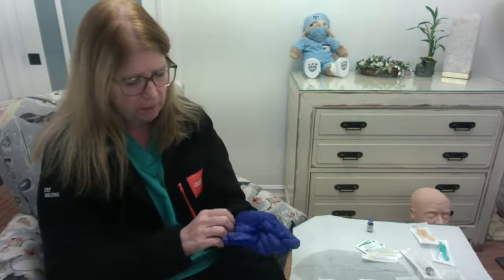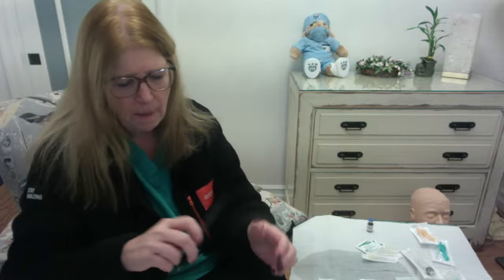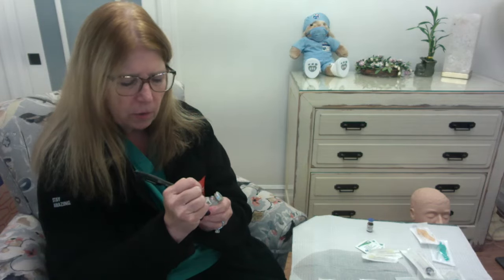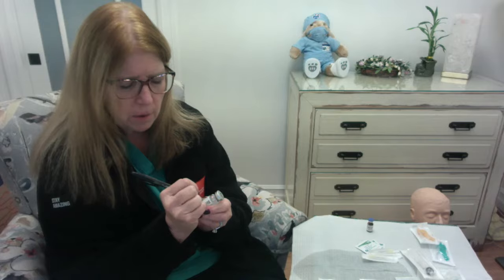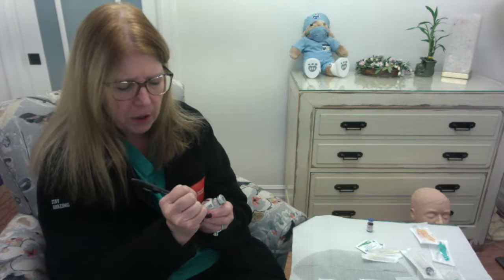So I would have to take my pen. Okay, let me just take my gloves off here. I would have to take my pen, and basically I need to write on the label the date that it was opened, right? I'm going to write the word open, and I'm going to say 10/14, and I'm going to say, I don't know, 3 p.m., and I'm going to put my initials.